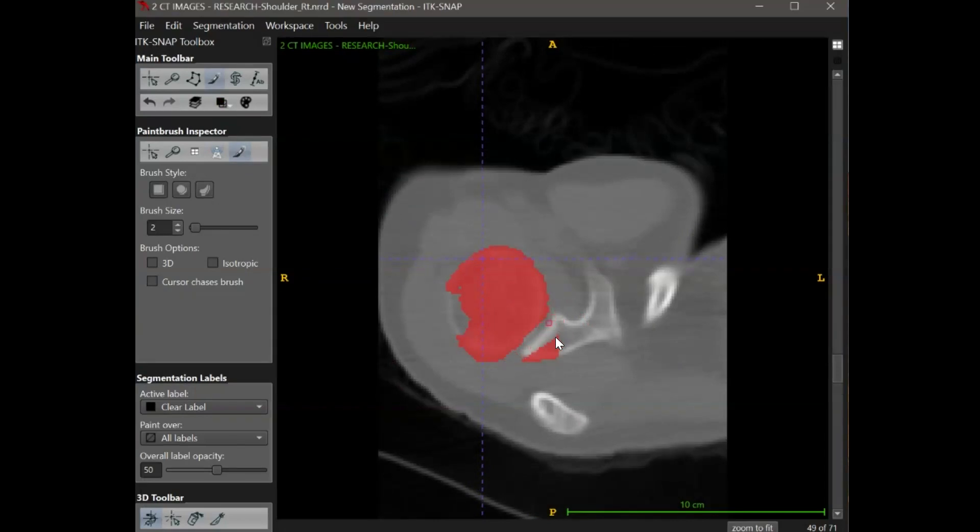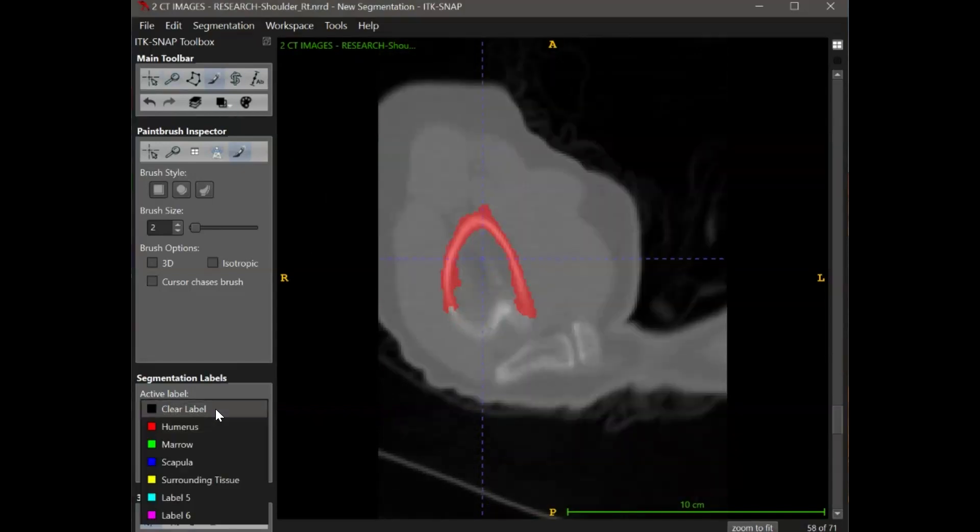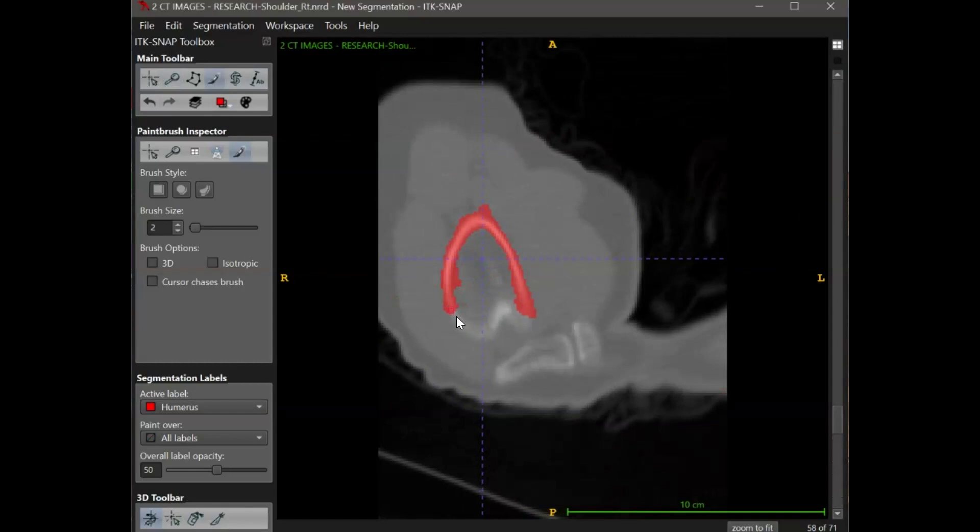In this case, I will go back and take out the scapula section with the clear label 0. You can also go back in and add in any sections that were left out as gaps from the active contour segmentation.